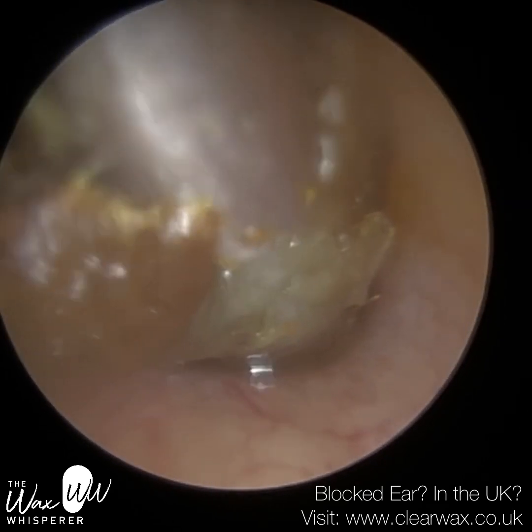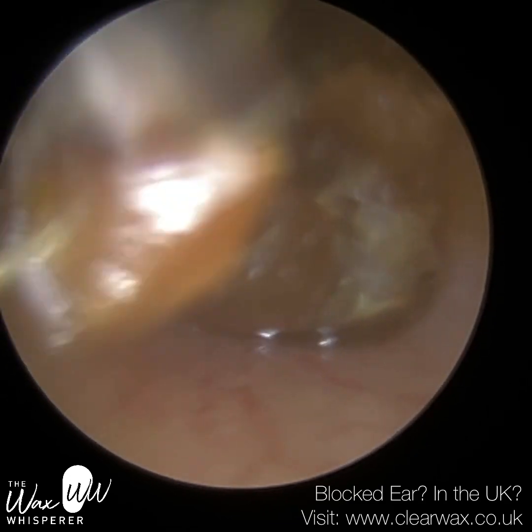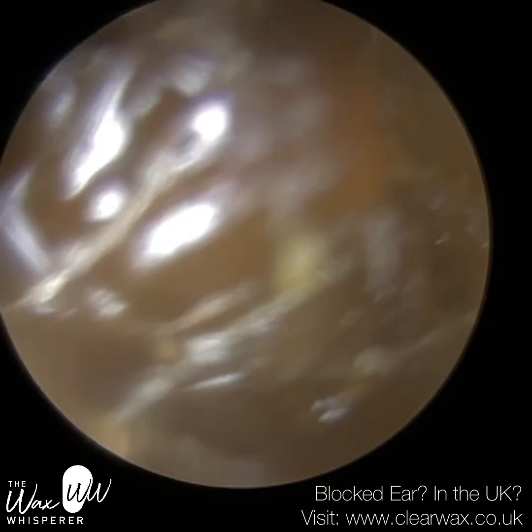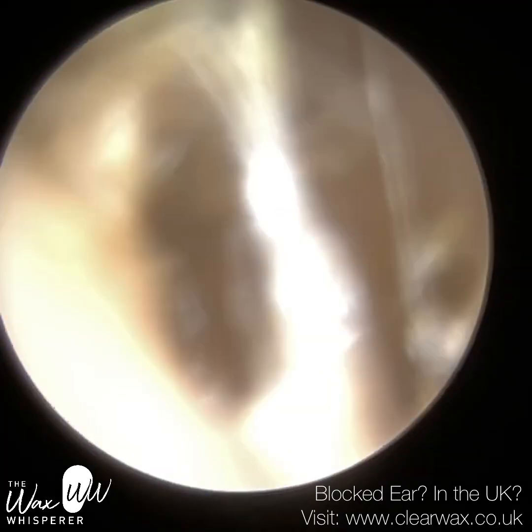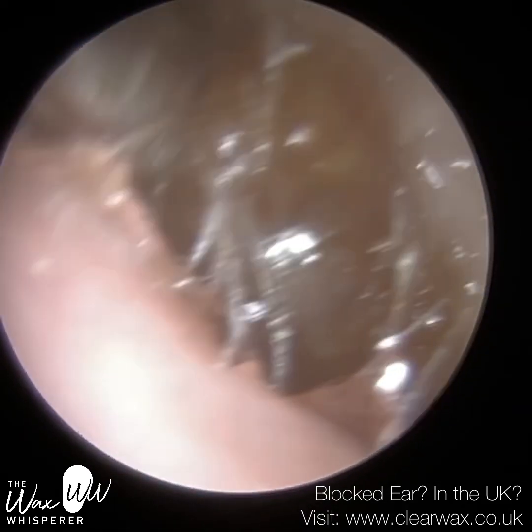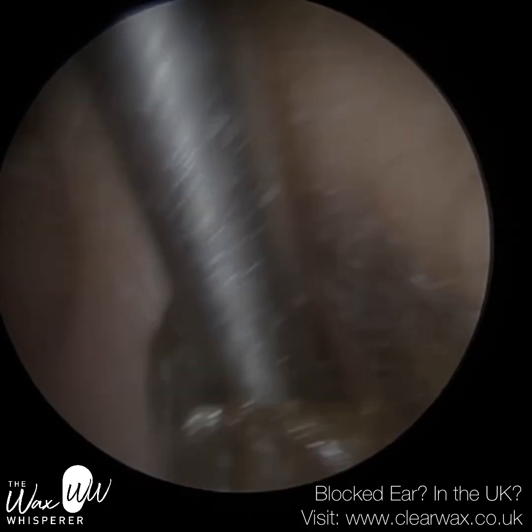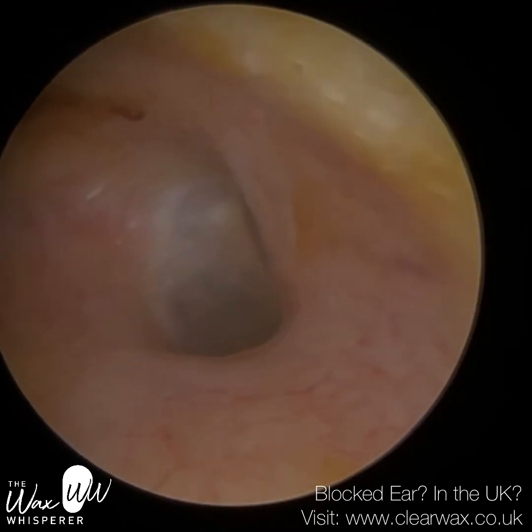And the technique I'm using at the moment, just reaching to the bottom of the wax plug and lifting up. That's because you will see, once I get this wax plug out, that this patient's got quite a prominent inferior recess. Our ear canals, as they travel towards the eardrum, have a slight incline, and that incline is approximately 32 degrees. But about half a centimetre in front of the eardrum, the ear canal suddenly dips down, and that creates a recess, an inferior recess.